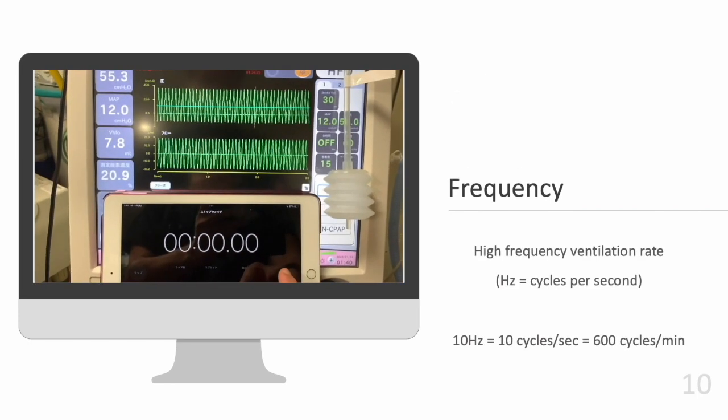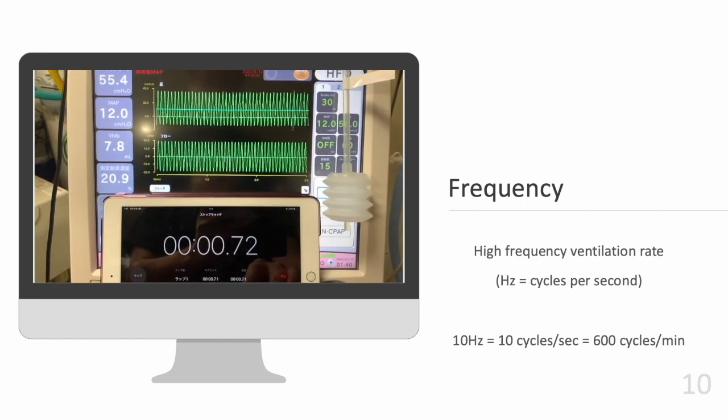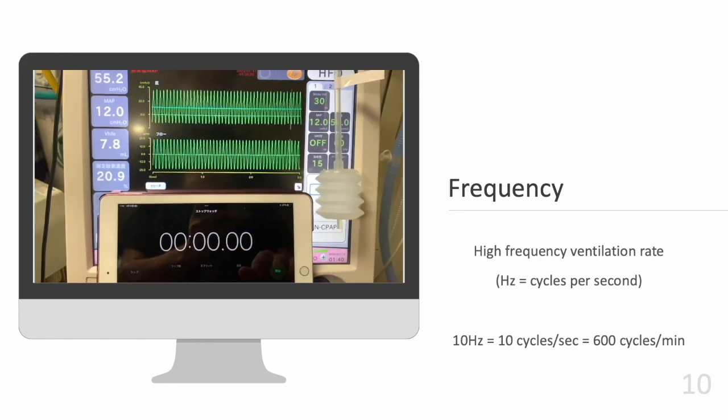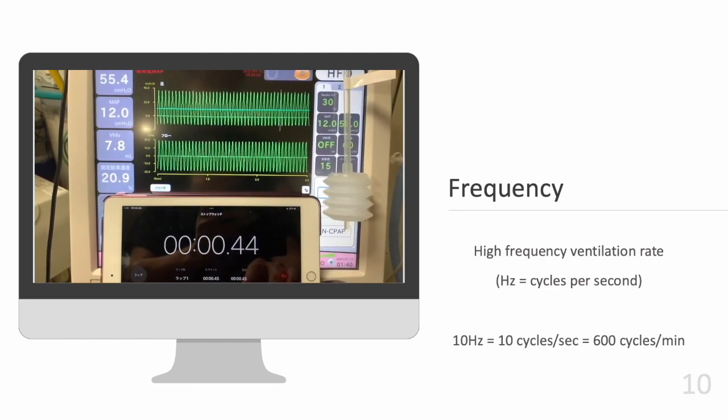Earlier, we talked about frequency. The number of breaths delivered by an HFO is expressed in Hz. At 10 Hz, this corresponds to 10 times per second, or 600 times per minute.